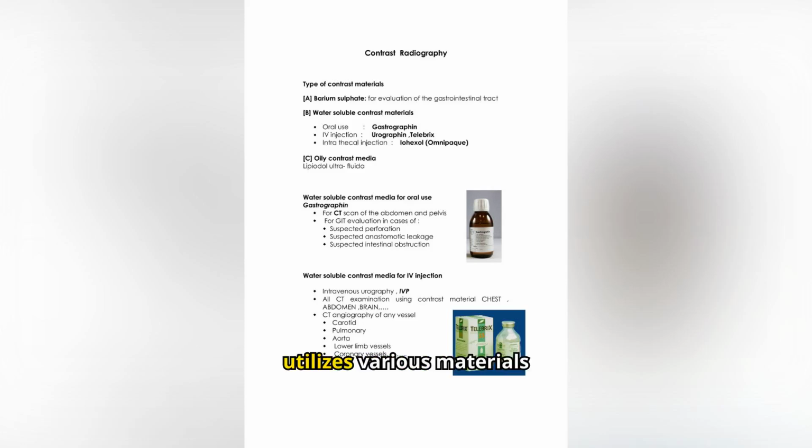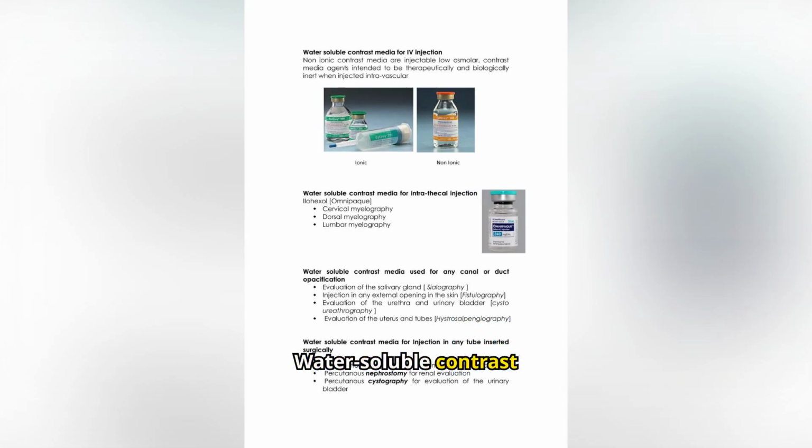Contrast radiography utilizes various materials like barium sulphate and water-soluble media to enhance imaging of internal structures, aiding in accurate diagnosis and treatment planning. Water-soluble contrast media, both ionic and non-ionic, are injected intravenously for comprehensive imaging of vascular structures and organs, ensuring precise evaluations of various medical conditions.